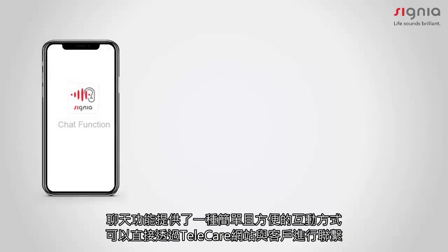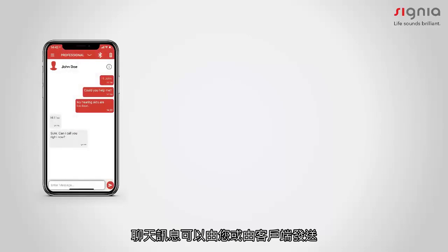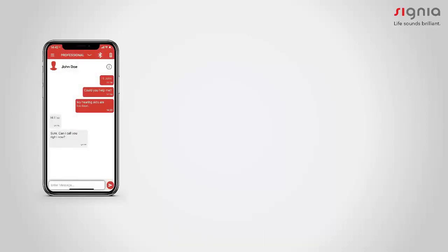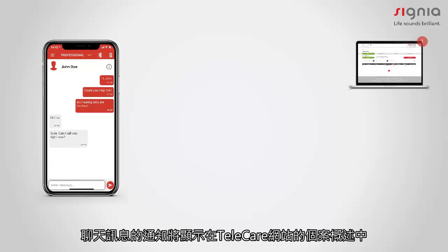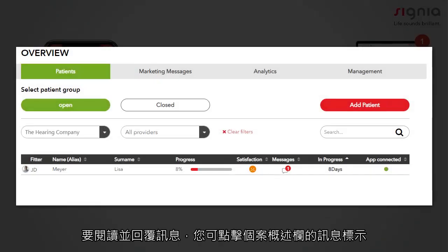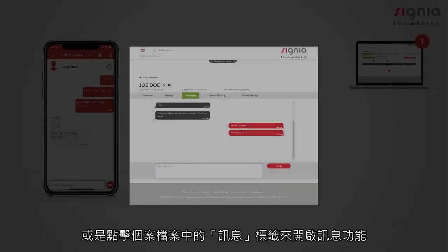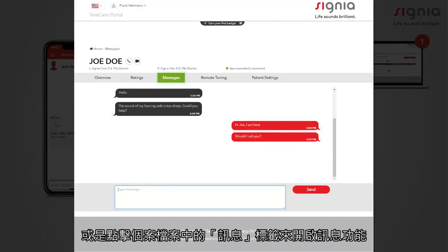The chat function offers an easy and flexible way of communicating with your clients directly via the Telecare portal. Chat messages can be sent by you as well as by your client. Notifications on new chat messages will be shown in the patient overview in the Telecare portal. To read chat messages and reply to them, you can click the chat icon in the patient overview. You can also access the chat function by clicking on Messages in the patient profile.